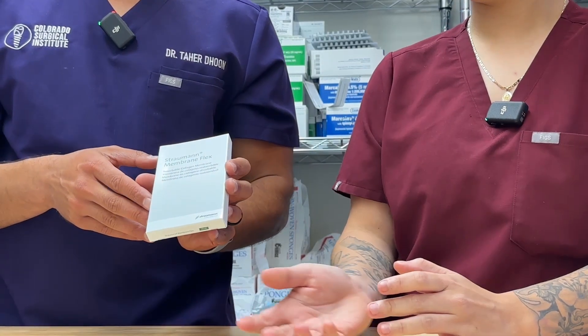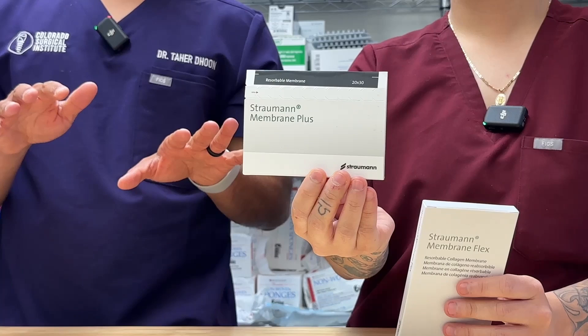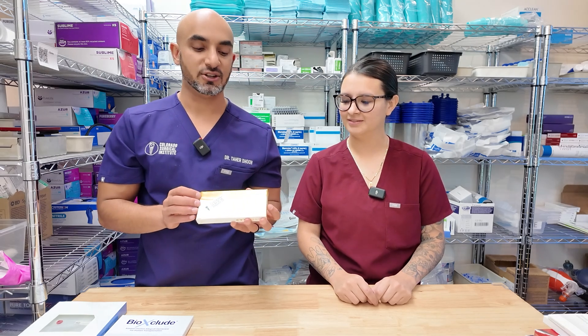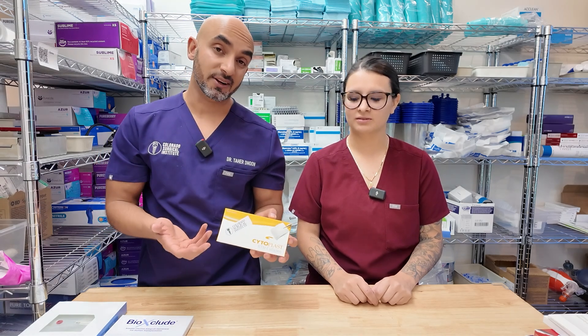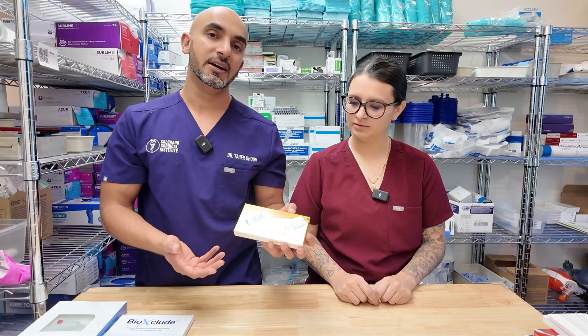Over here you have the Strommen Membrane Flex — your standard collagen membrane. The Strommen Membrane Plus is in the same category; the only difference is the length of time it lasts. Both are good resorbable membranes for covering a graft material or just holding the space a little bit better. If you want to use a tacking kit or a ProFix kit, I like to use a rubber dam punch on these membranes — you create a small hole, drill your screw through it, and fixate it down to the bone. The Cytoplast RTM collagen membrane from Osteogenics is another option. Ossix has really good membranes, and BioHorizons has some good membranes and biologic choices as well.